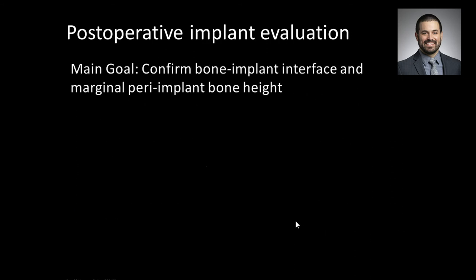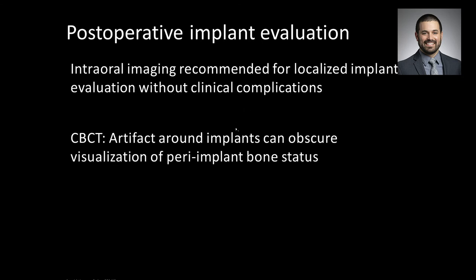All right. We'll leave that preoperative assessment scenario behind and discuss postoperative implant evaluation. This is where the implant is in and the patient's back. They may be asymptomatic and you're evaluating to make sure everything's going well. They may have symptoms or problems they're complaining about. So the main goal is to confirm your bone implant interface, to make sure that the implant is integrated.